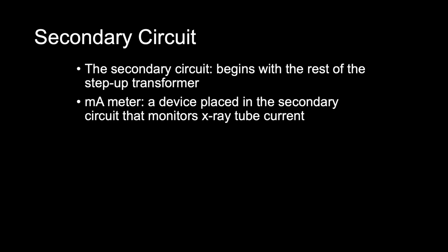The secondary circuit begins with the rest of the step-up transformer. The milliampere meter, or mA meter, is simply a device placed in the secondary circuit that monitors the X-ray tube current.